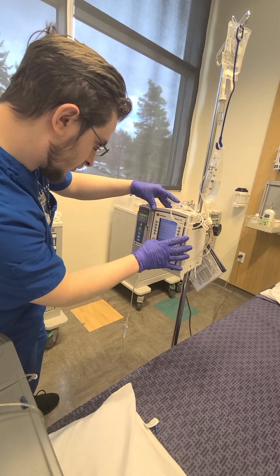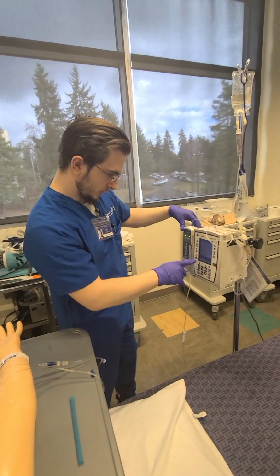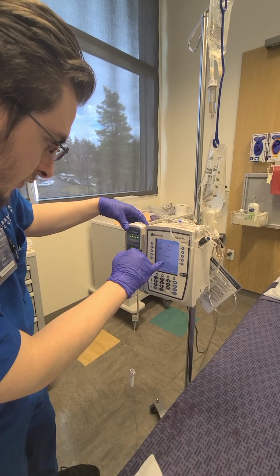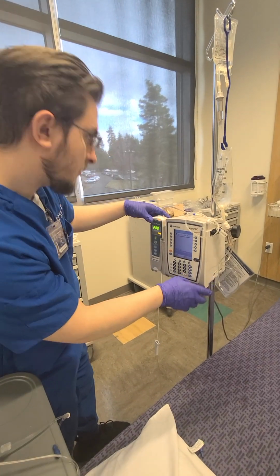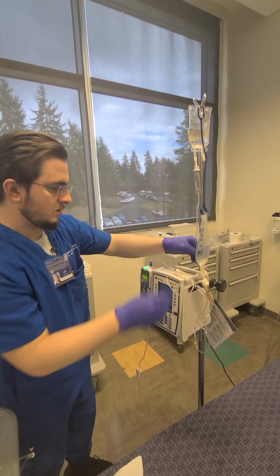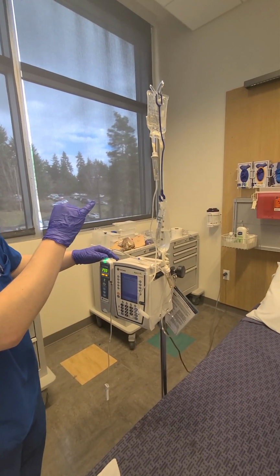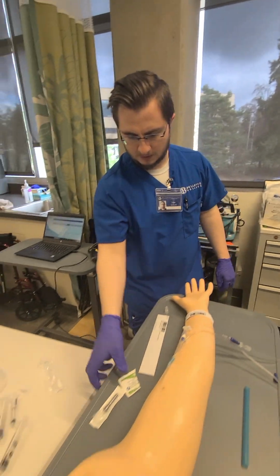Then we go to our secondary, which is going to be ciprofloxacin. I already did all my checks and made sure I scanned it in, so we're all good there. It is 400 milligrams and 200 milliliters, so we'll click that. Is that correct? It is 400 milligrams, 200 milliliter diluent, dose 400 milligrams. Good. Next. Then we can hit start. Check that, make sure my lines are still all closed. It's dripping. It's running. Make sure to check for patency still.